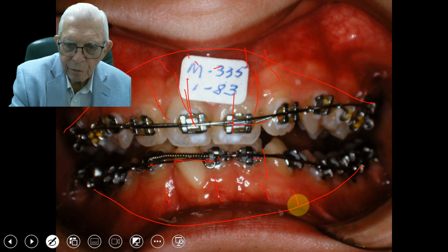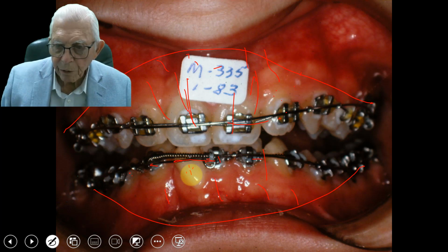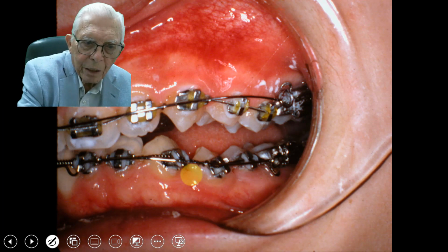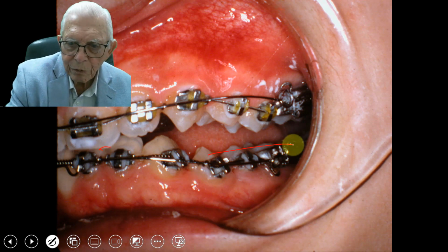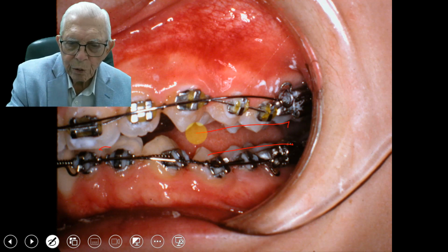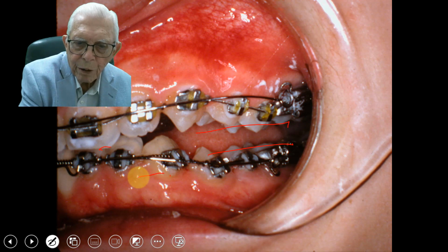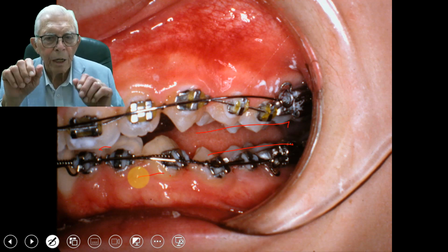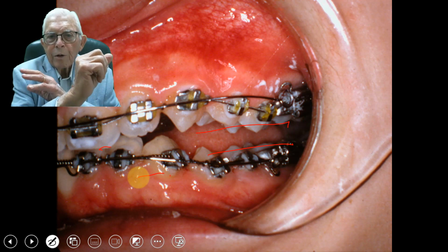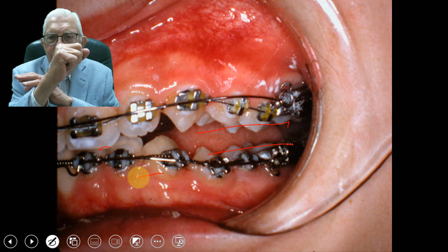And we're going to have to do a lot of rotation and making some spots down here to work in. Now, when we open the bite here, this is how much of a gap we had back in this area right here. So we're going to advance this young man's mandible and bring it out. And the condyle back here, if this is going forward right here, you'd have the condyle here and you kind of lean it back this way.